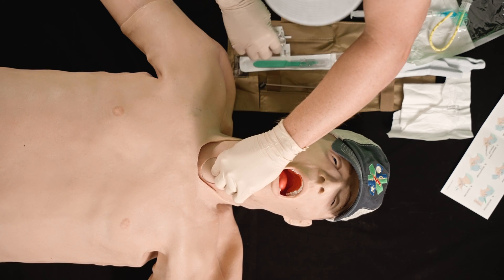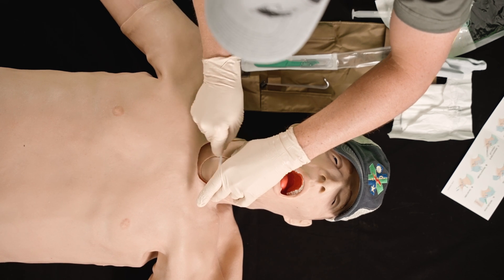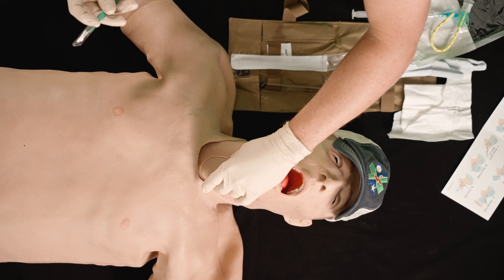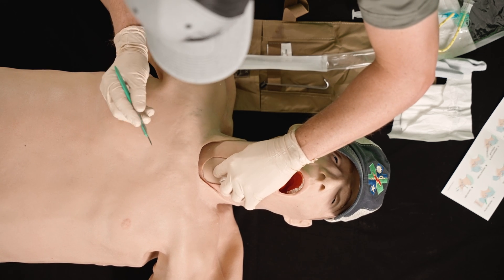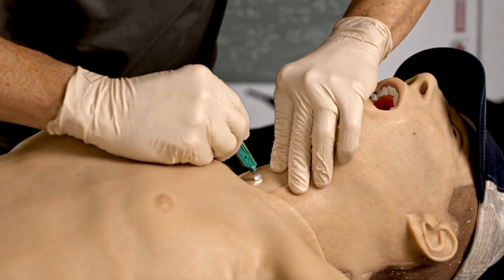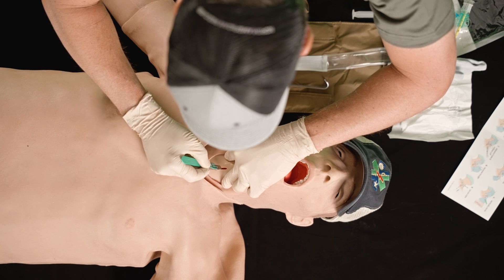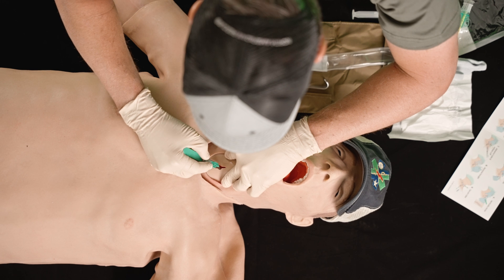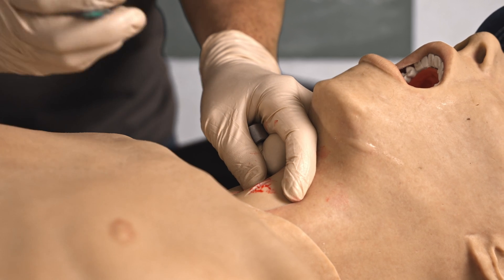I'm going to use my non-dominant hand to hold that landmark, and I'll use my swab stick to clean the area. Then I take my scalpel — I've identified my landmark — and I'm going to do one solid motion, centerline down. As I see it start to open, I'm going to make a sideways motion and flip, completing the horizontal incision.